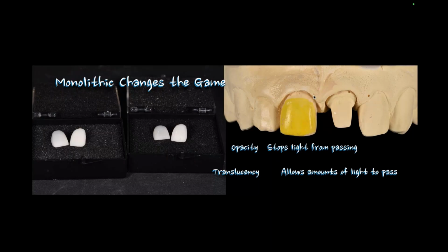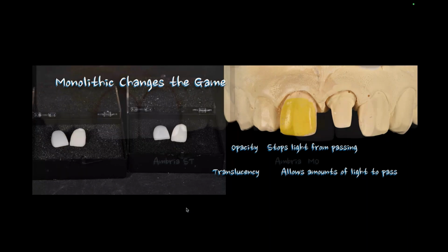So I took some pressing materials and I pressed out a case for, we're going to layer both of them, but I pressed them out a little more full contour-esque just to kind of see where I'm going. And when I pressed it out, I thought everything was fine. And then I went back and I looked at the prep shade photos. And you're going to see what happened. I actually wound up pressing out a second set. Now, again, they're not done yet. So I'm just kind of getting them ready.